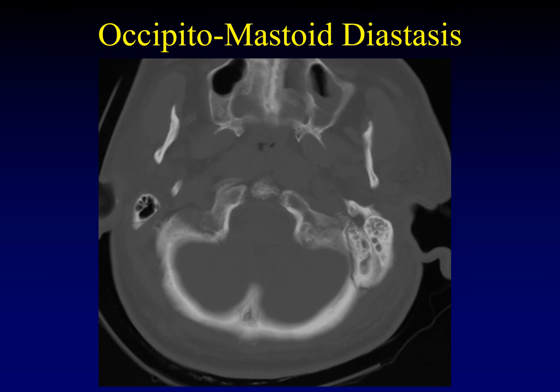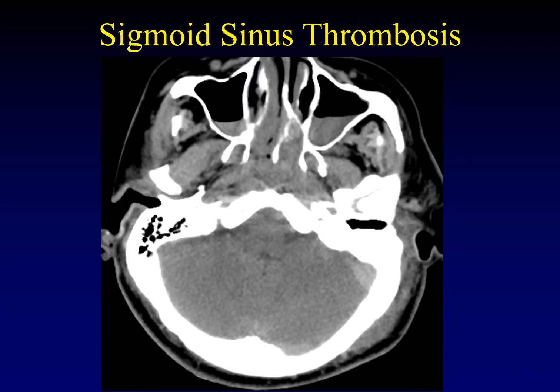Sometimes temporal bone fractures extend more inferiorly into the suture lines, causing diastasis of the lower skull base sutures. In particular, the occipitomastoid suture — running just medial to the most inferior mastoid air cells — can become diastased. You can imagine the risk this poses to the sigmoid sinus. Here's an example of sigmoid sinus thrombosis. Even on unenhanced scans, particularly when fractures violate the sigmoid plate — the thin bone covering the sigmoid sinus — we should be looking for this. The thrombus should be denser than the surrounding intracranial contents, so a CT venogram isn't necessarily required.